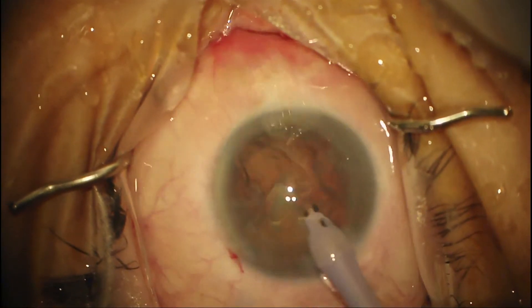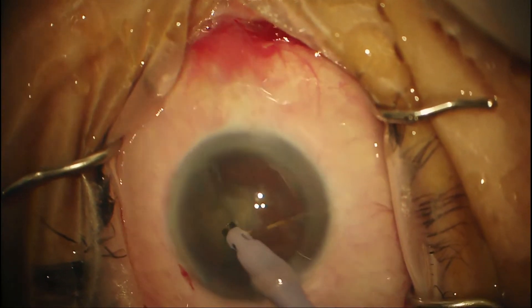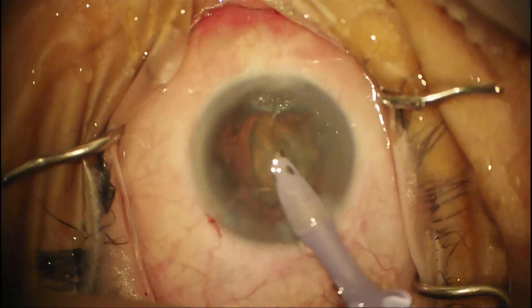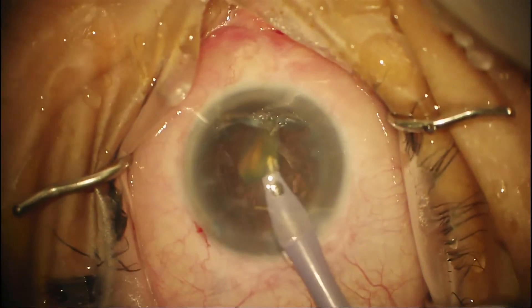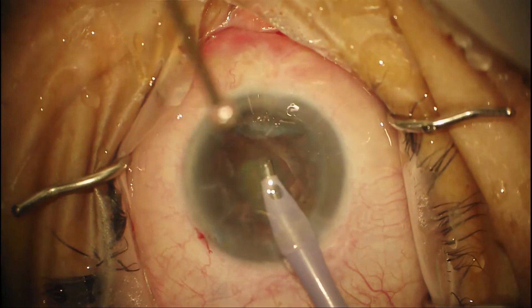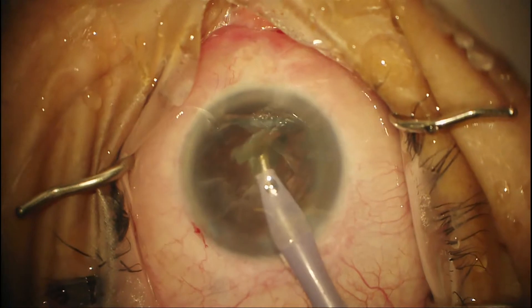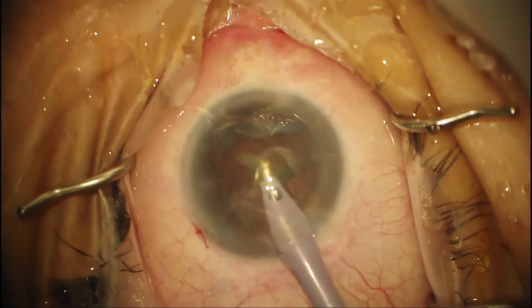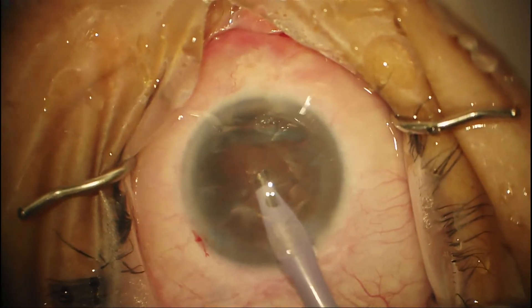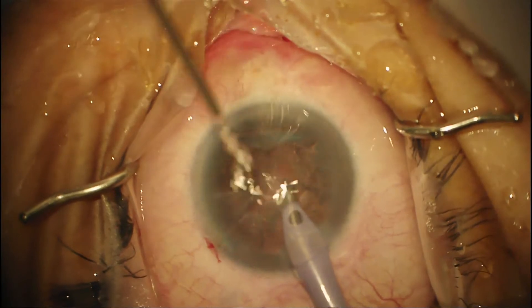Instead of going to grab the piece right there, I'm going to rotate it away from me so that I can have more control and know my depth in the eye better. Now I can grab the top of the pie crust and bring it up into the iris plane. On my last piece, if I haven't removed my second instrument, I would remove it at this point — that gives a lot of stability. Modern phaco machines have very little surge, but you want to err on the side of eating that last piece more anteriorly so the posterior capsule doesn't trampoline.